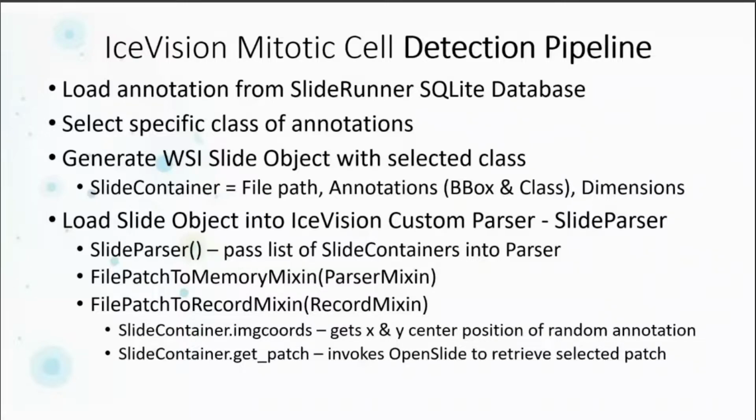Yeah, well, actually, I do have a question. About the information of the original size of those cells, because here we have just the excerpts. You had said there are 512 by 512 pixels, but do we know what is their actual size? Because I can imagine that could be valuable information.